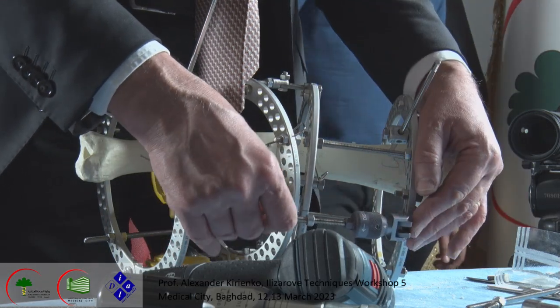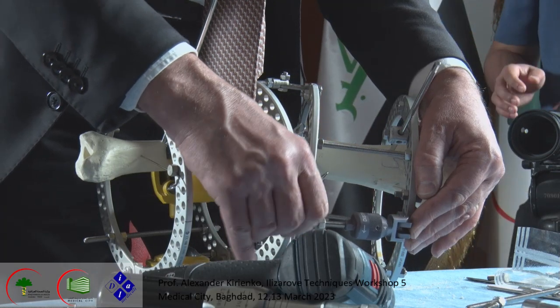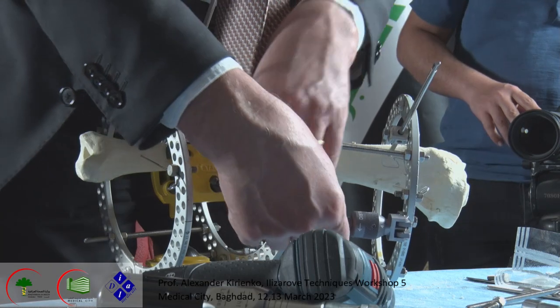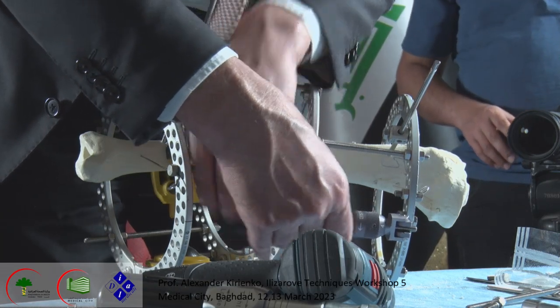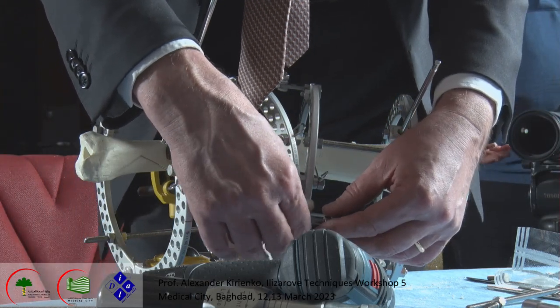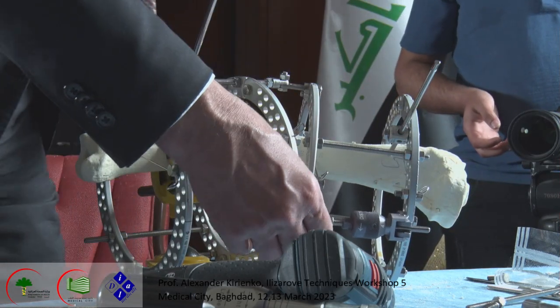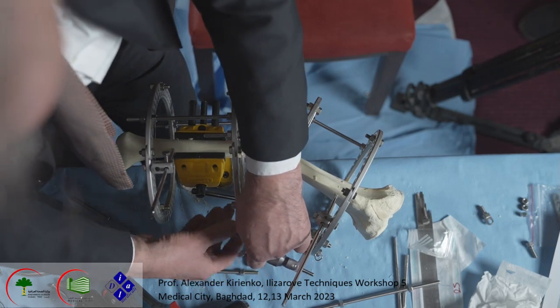This is a comfortable system because you may turn it continuously without using the wrenches. After that, it depends on you. It is a little bit of your fantasy.